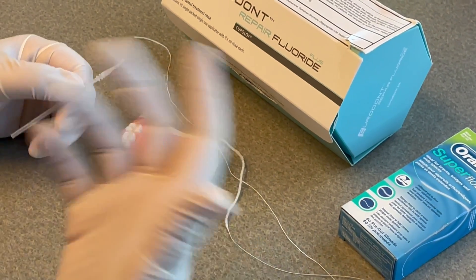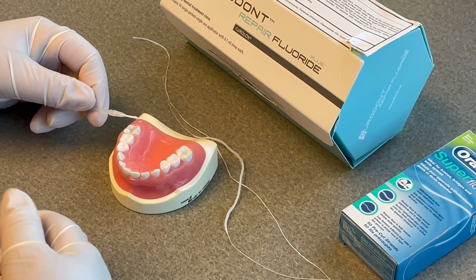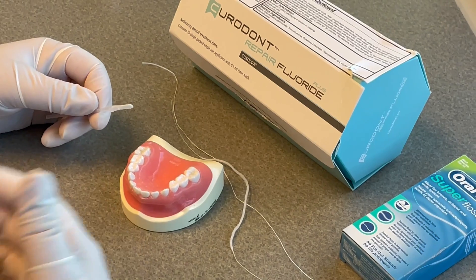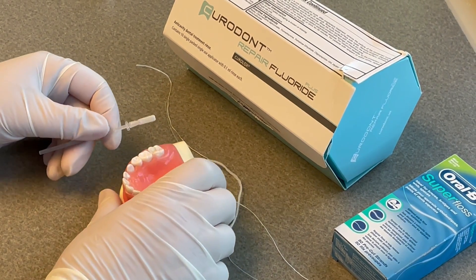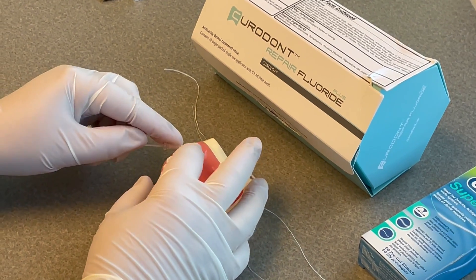One way you could do it is put separators in and have them come back so you could directly apply it proximally. But having to do extra appointments is time-consuming and hard for the patients. Another way you could do it is just put the sponge between the teeth.